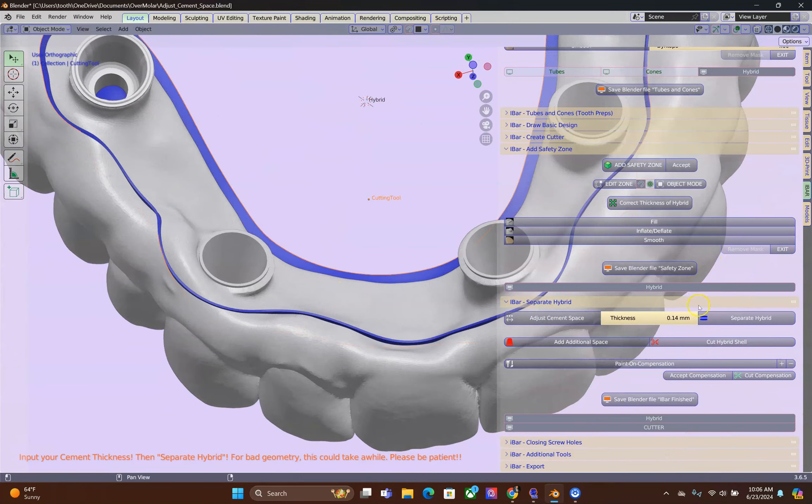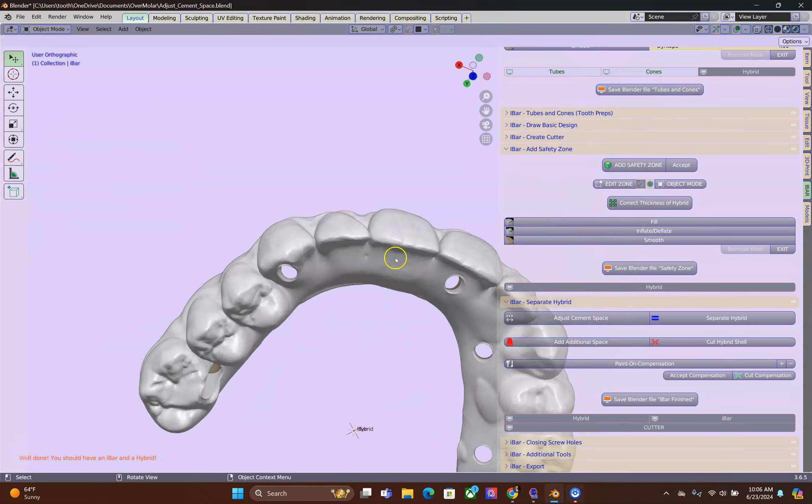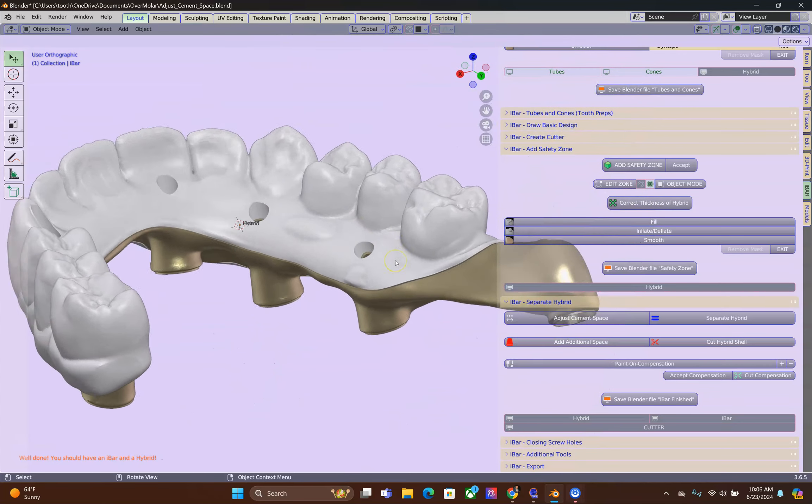Alright, we are going to separate the hybrid. And this is the outcome.